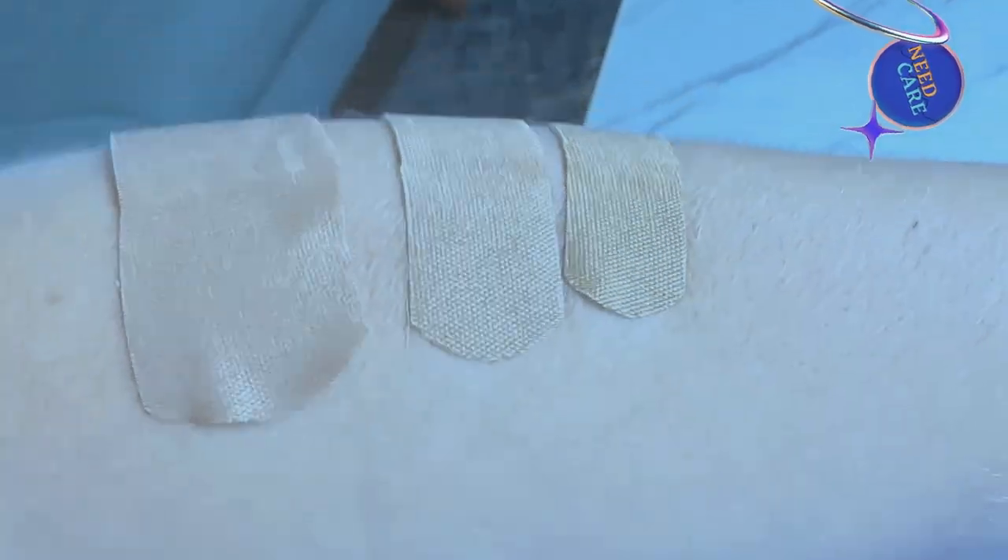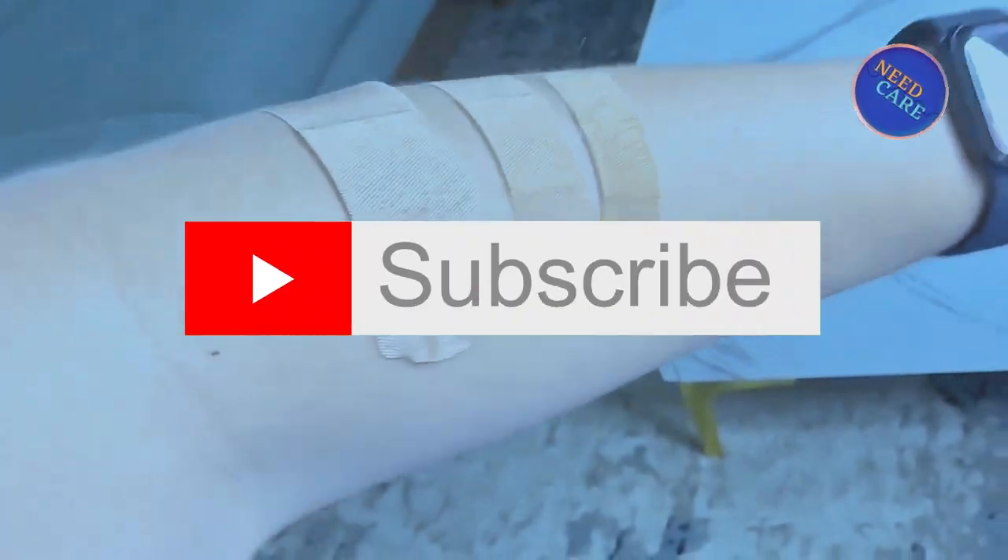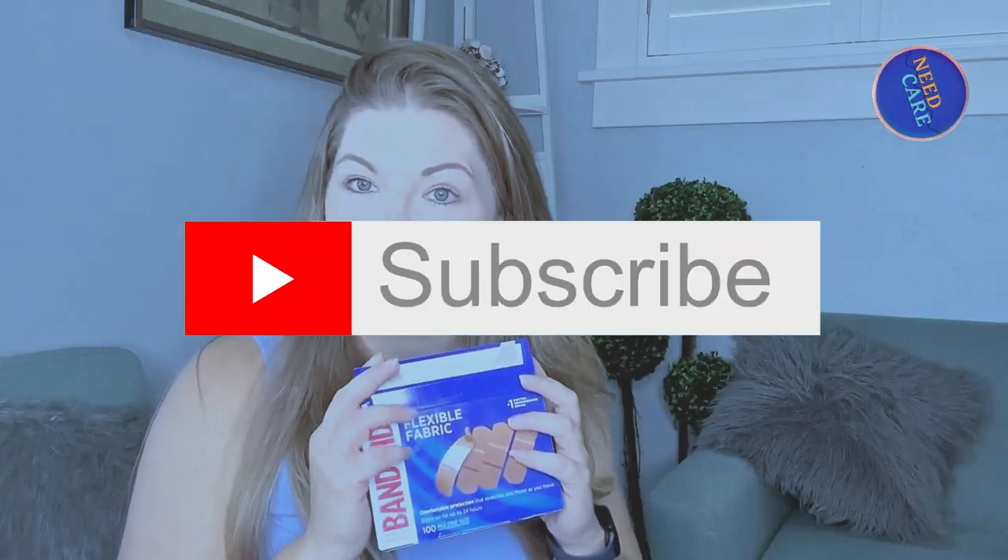And they have the little cushion here that is going to soak up anything if it has to or if it's wet. That part there is sterile. So you're going to want to put that on the wound and then put the bandaid on. This is just for demonstration purposes, but it is skin colored and it has a flexible fabric on it, which is really nice. So that's your one option.